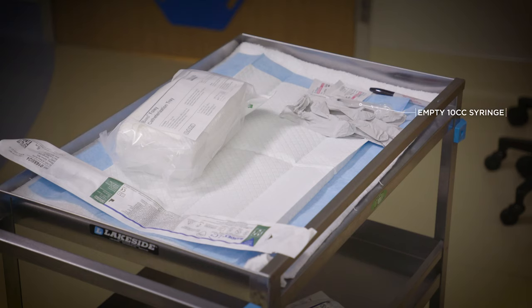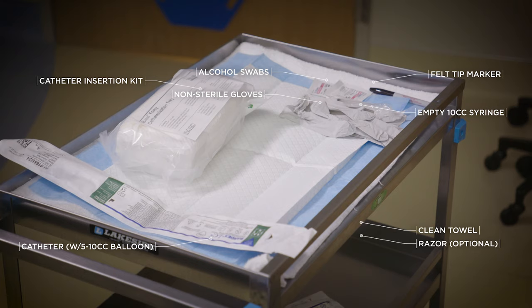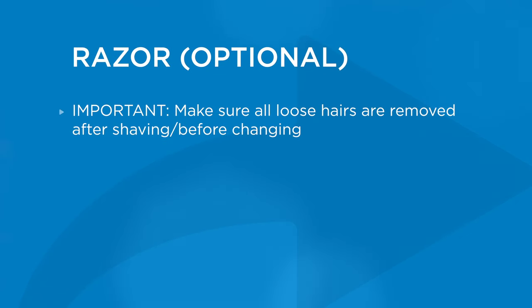Here are the supplies you'll need to complete a suprapubic catheter change: an empty syringe, which you'll need to remove the old catheter; a catheter insertion kit; a new catheter — make sure you have the correct size with a 5 to 10 cc balloon; a felt tip marker; a clean towel; non-sterile gloves; alcohol swabs; and a razor, which is optional if you need to shave around the catheter area before changing. It's important to make sure all loose hairs are removed after shaving and before changing.